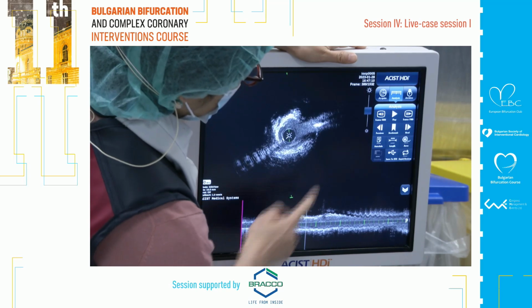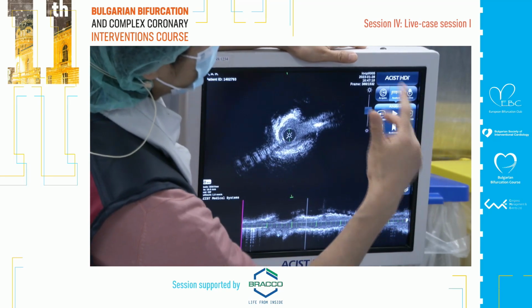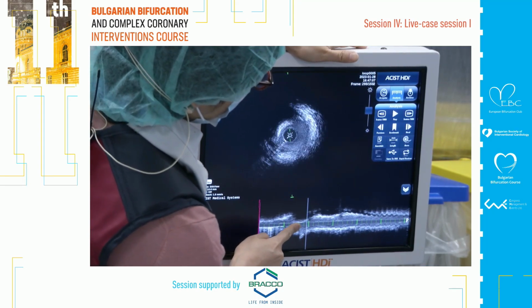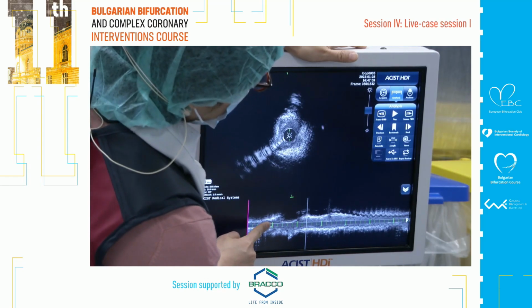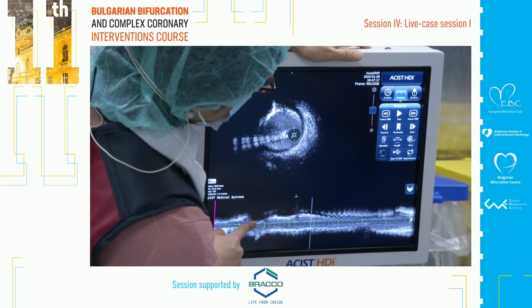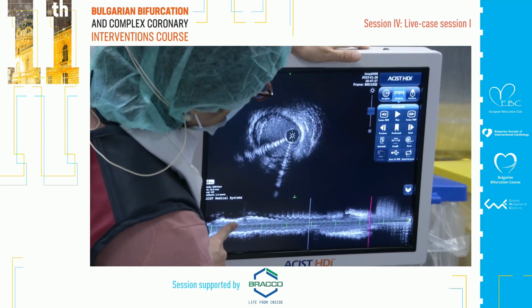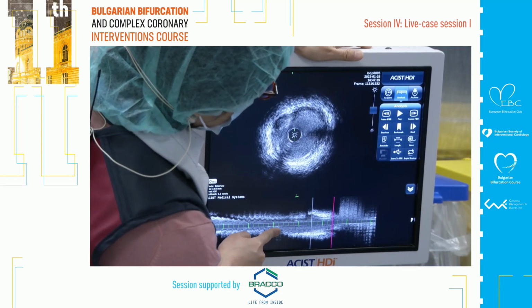So go distally. This is wired, your proximal diag. So first diag, and there is almost a twin diag. So this is diag, and this is one more diag, right? So your lesion is just distal to the first diag, right? Okay, that's number one. And then come back. Proximal to the big two diags the vessel gets bigger, and in between it's okay, nothing. And this is the circumflex.